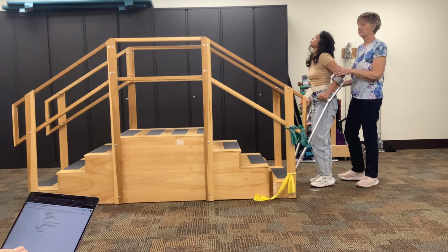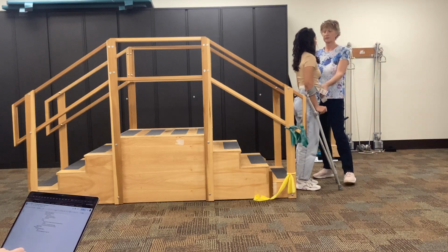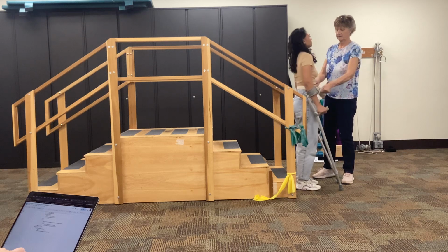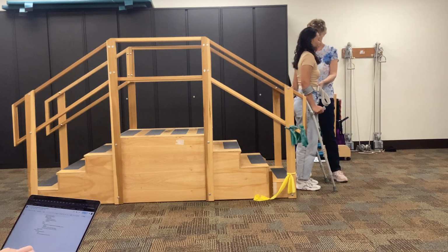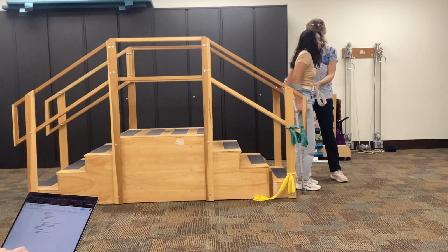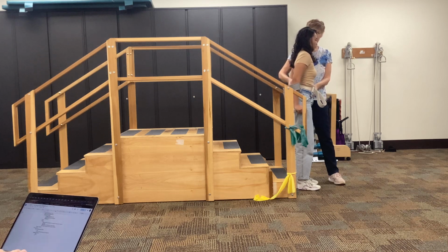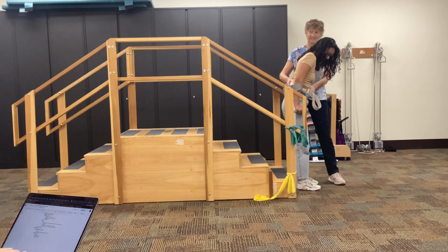All right, turn and face me. So, did you notice in your book it showed the backward method up the stairs? You need to put your hair up for that. All right, so crutches back. Not on the stairs, just back here. All right, now you really gotta bend, hike your bottom up into the air, and put your feet on that first step. You have a lot of faith in me. Yeah, I do. Okay, ready?